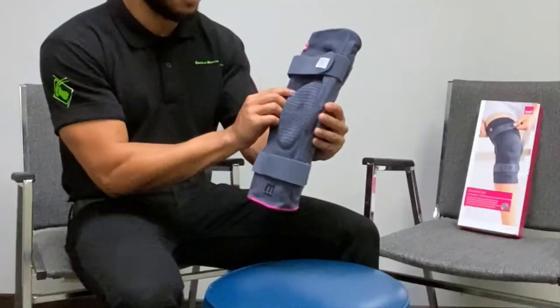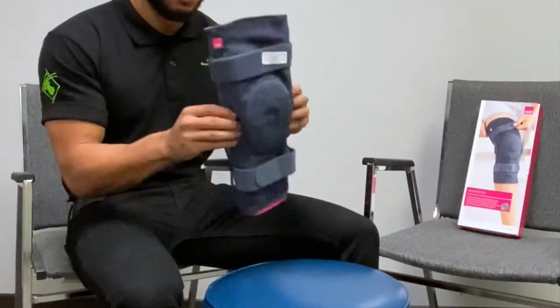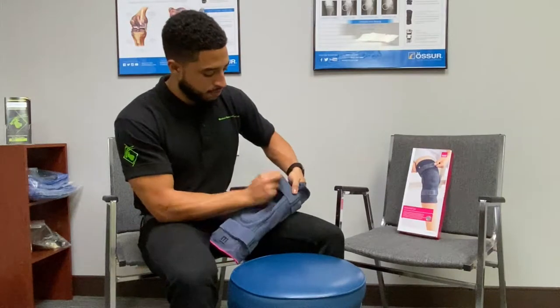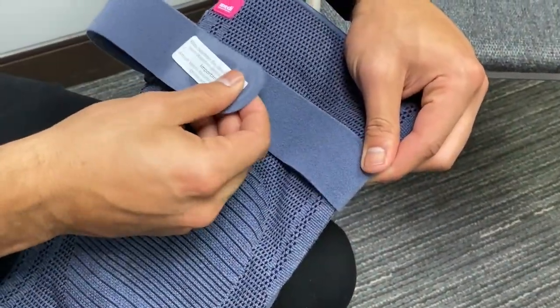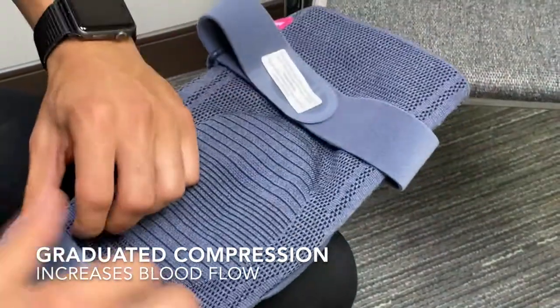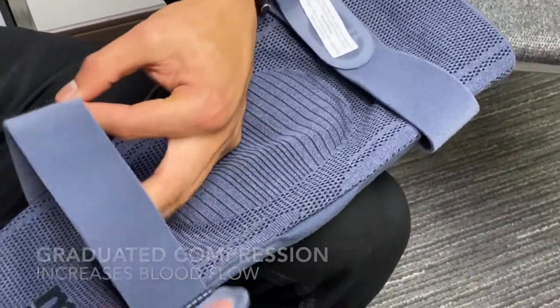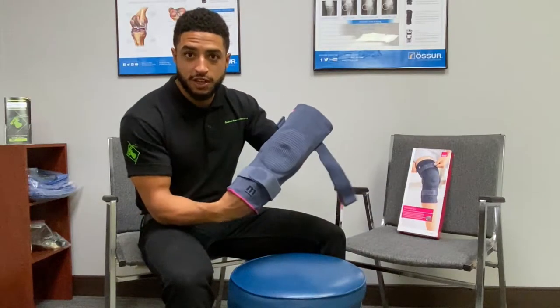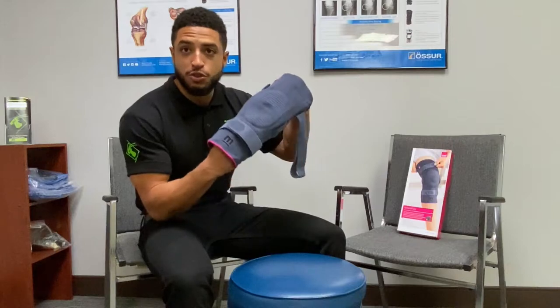So this is the GenuMedi Pro Double Hinged Knee Brace here. The brace is knitted with graduated compression. The graduated compression helps increase blood flow to the affected region — in this case, you'll be getting added blood flow to your knee.